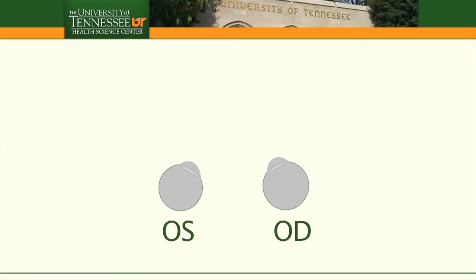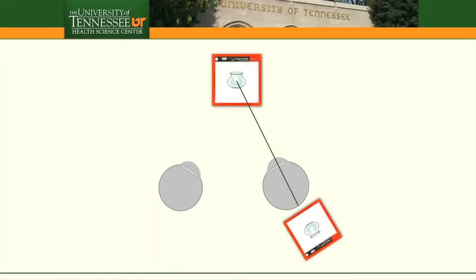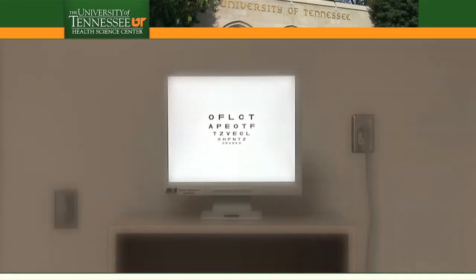Under normal circumstances, the brain develops to correlate the visual input at each fovea as coming from straight in front. In the presence of no deviation, the two retinal images from the troposcope are subjectively projected in cortical alignment. This is what they would see in free space. Vision is harmonious, there is no diplopia.